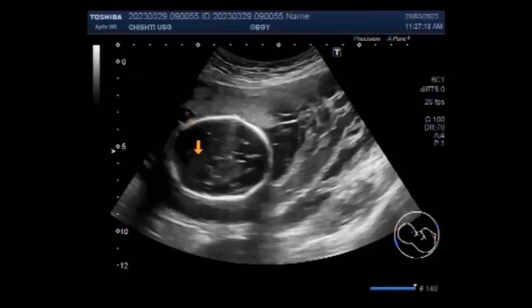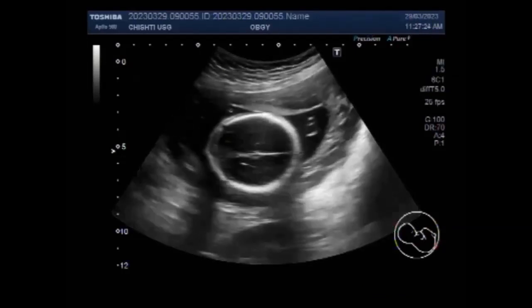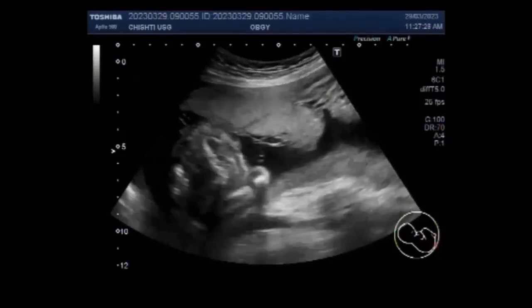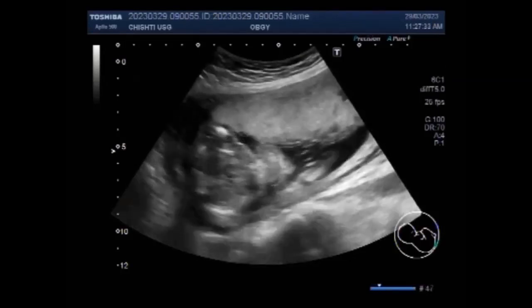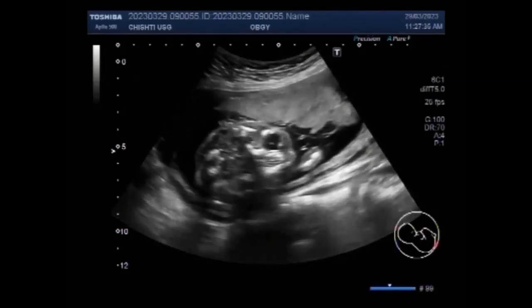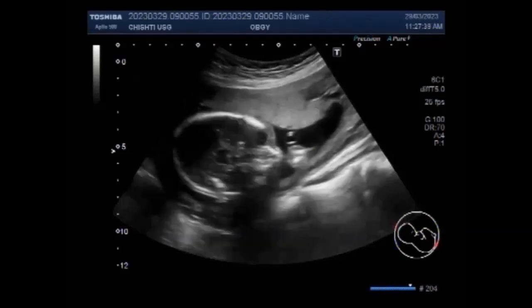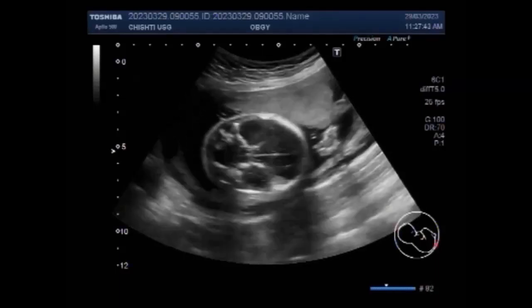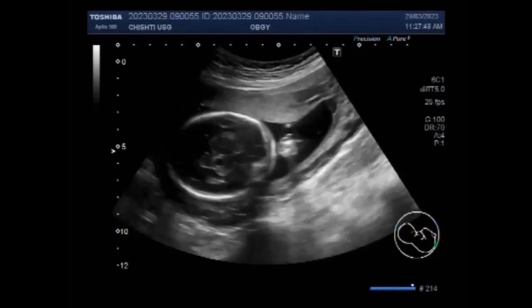A molar pregnancy is where there is a problem with the fertilized egg, which means a baby and placenta do not develop the way they should after conception. A molar pregnancy will not be able to survive. It happens by chance and is very rare. But in this case, the fetus is active, alive, no fetal anomaly is seen, and partial hydatidiform mole is seen.